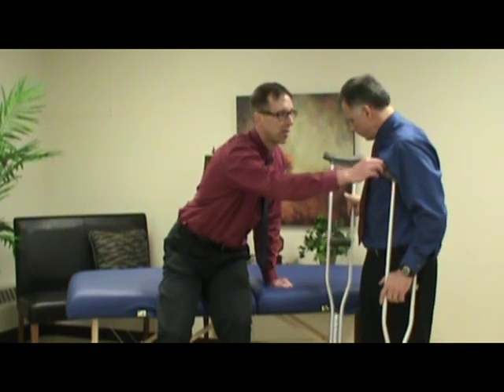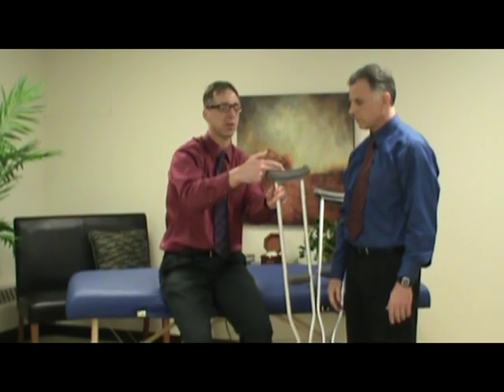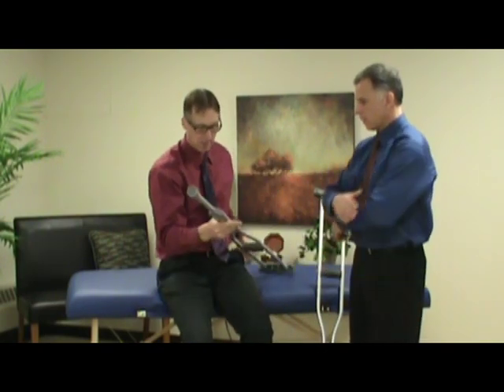So what's the first step we're going to do? Well, the first step is we're going to adjust the length. Right now you can see it's jamming up into his armpit. So you want to adjust it to the point where you can actually get two fingers between the top of the crutch and his armpit, easily.